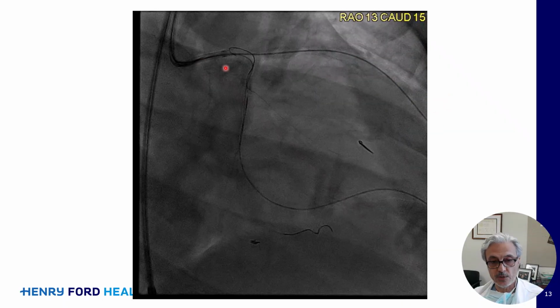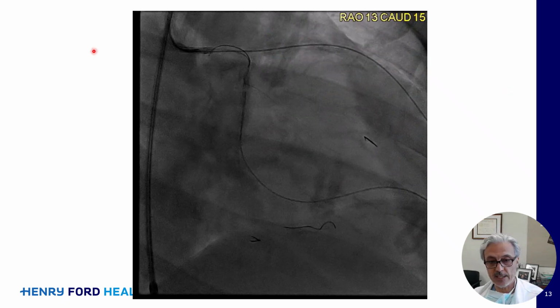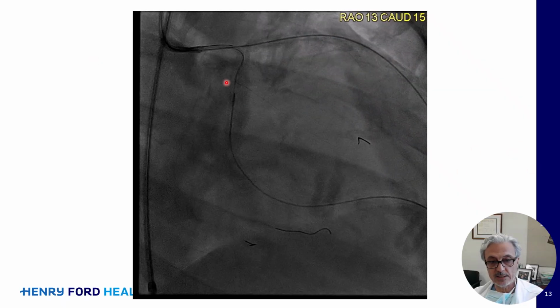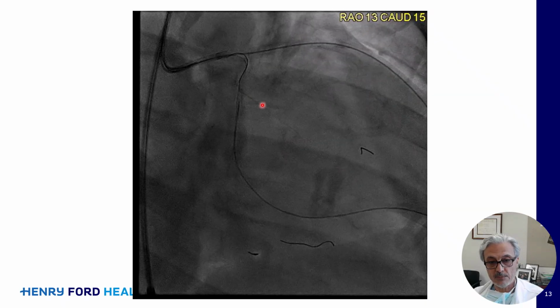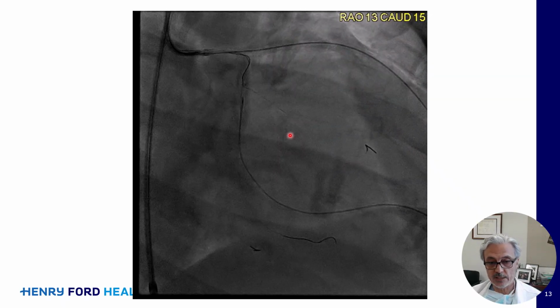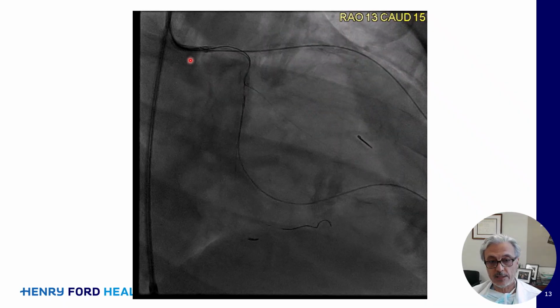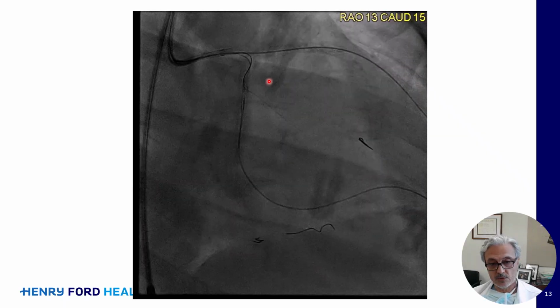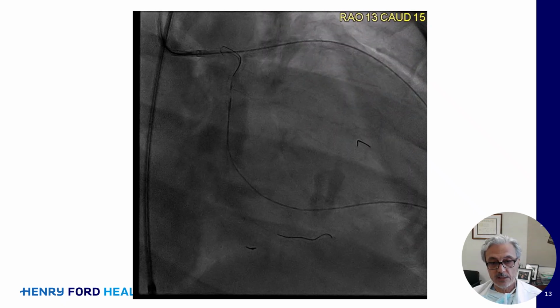When you have a single guide catheter, it's hard, because when you push the microcatheter, it actually kicks the guide back. But we were able to advance the microcatheter as high as possible, and at this stage the microcatheter probably ran out of length, so I needed to do a maneuver to be able to switch to antegrade. The Suoh wire is not really a good wire to wire the guide catheter, so I exchanged it to a Fielder FC with a mild bend, and I was able to wire the guide with the Fielder FC. If you notice here, the wire is moving.